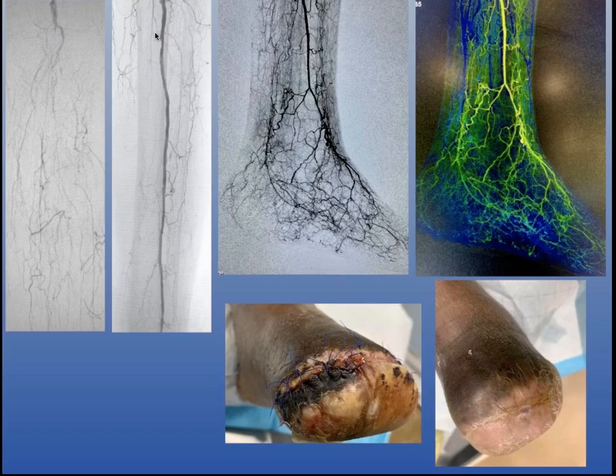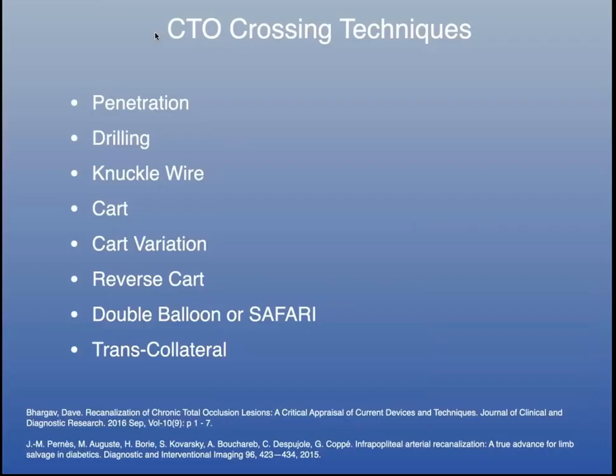And if you look at that image there now, next to the color image, you basically have a nice lateral foot angiogram, which is showing you the importance of this peroneal artery, giving huge anterior and posterior communicating branches and filling all these robust hibernating vessels in the foot, and luckily she ultimately went on to heal. And so that's an example of indirect revascularization.